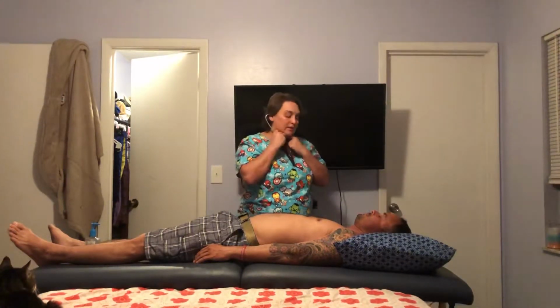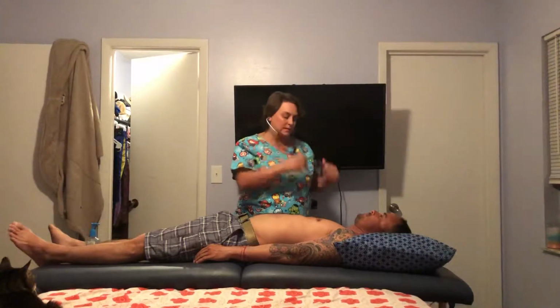And I'm just going to auscultate a little bit deeper and listen for a murmur.